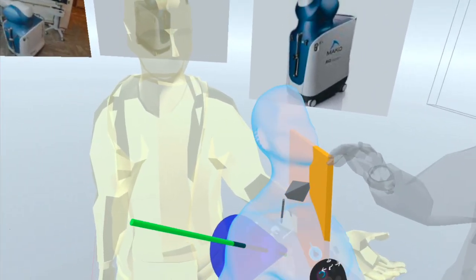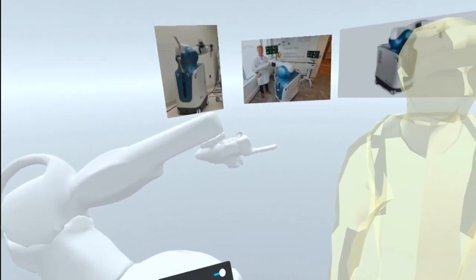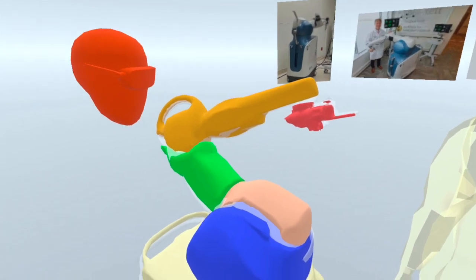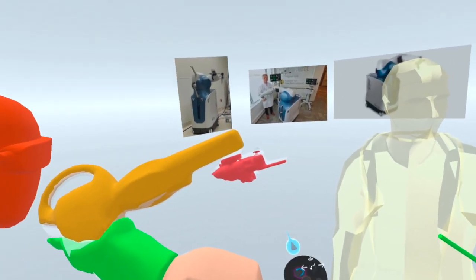Now we have plenty of space to work. This doctor will have to hold the retractors and this doctor too. Here we have the robot. Let's move to another scenario.